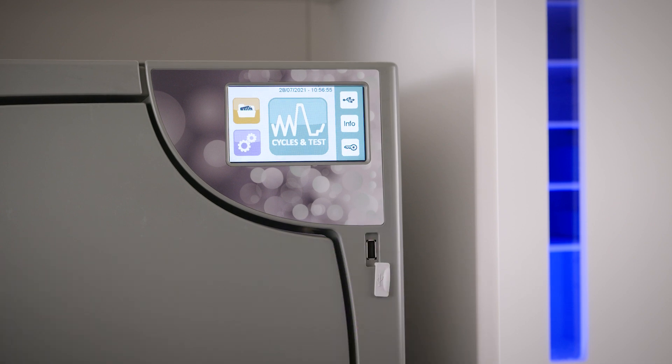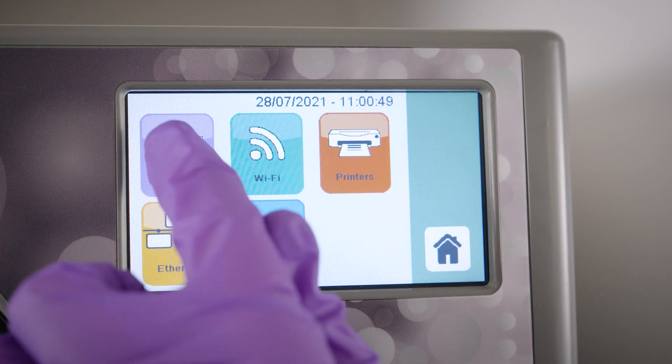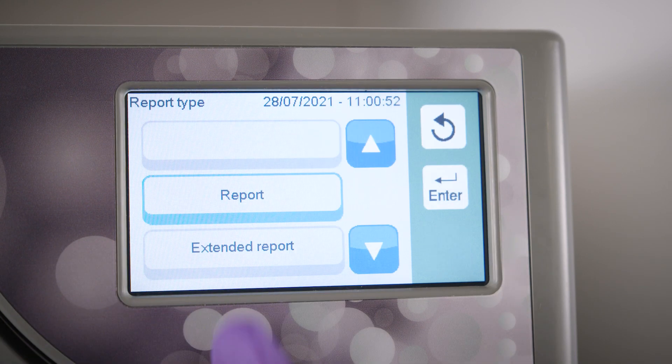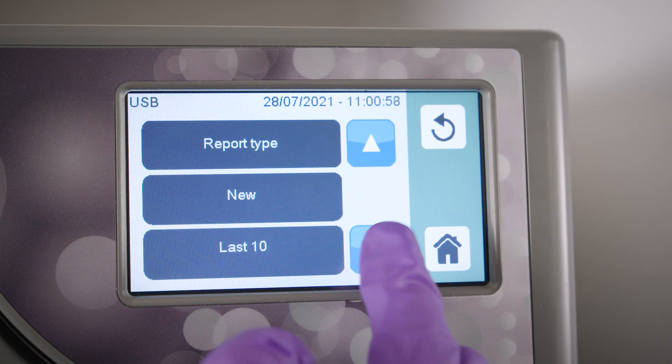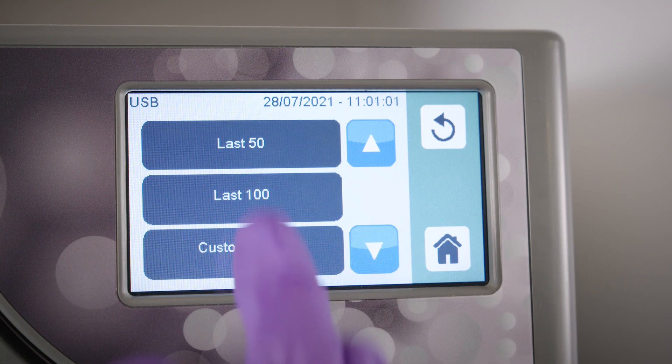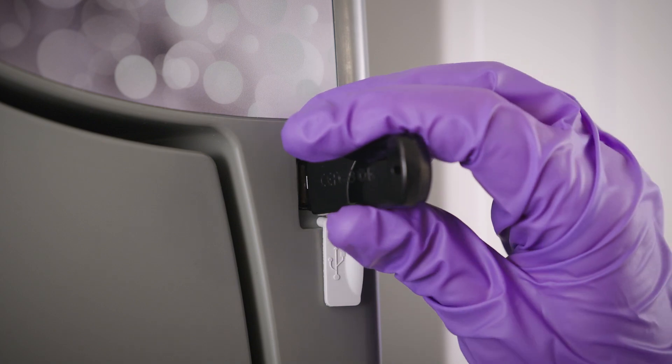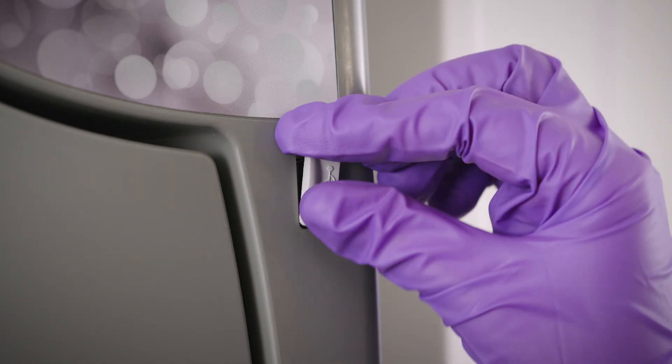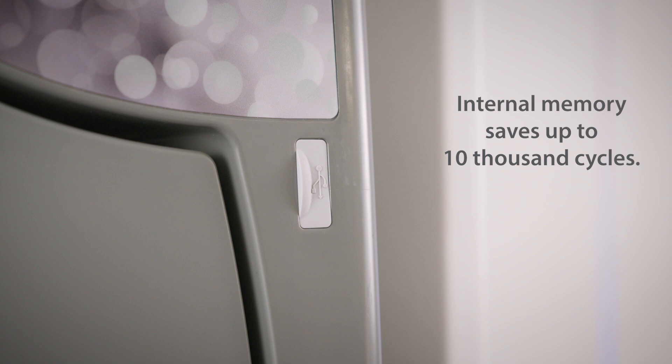To download the sterilization cycles and test files, select the Data Management icon and then press the USB icon. The cycle report files are in PDF format. It is possible to select the number of cycles to download onto the USB key. It is important to remember not to turn on your sterilizer while the USB is inserted into the machine. This is because the unit automatically looks for new software updates any time a USB is inserted when the machine is turned on. Since your Bravo G4 has enough built-in memory to save up to 10,000 cycles, having the USB inserted at all times is no longer necessary.